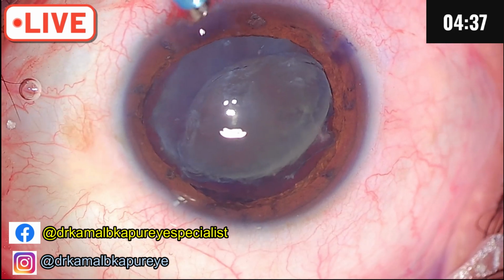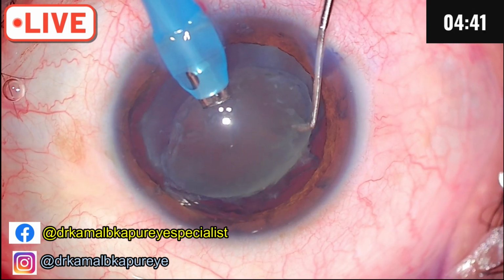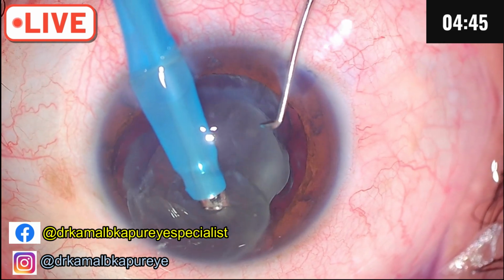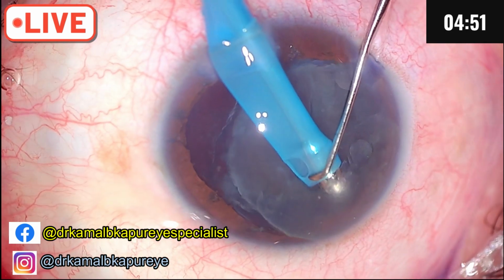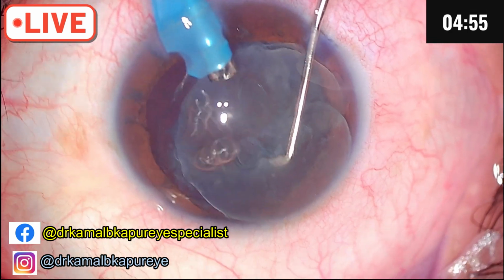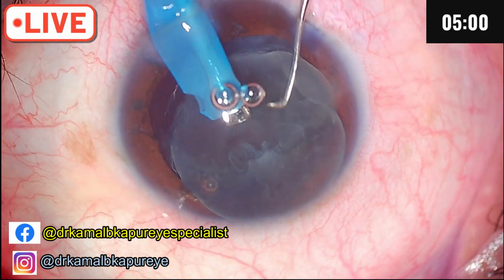And at no point fluctuation of the anterior chamber. Bottle height should be slightly low. So we will try and wheel out this cataract out. That would be the safest bet. So at least in case the cataract sinks, we don't have to go and fish it out from the vitreous.